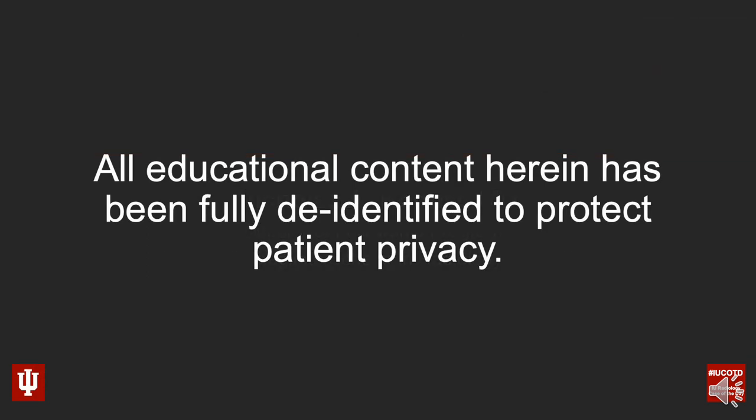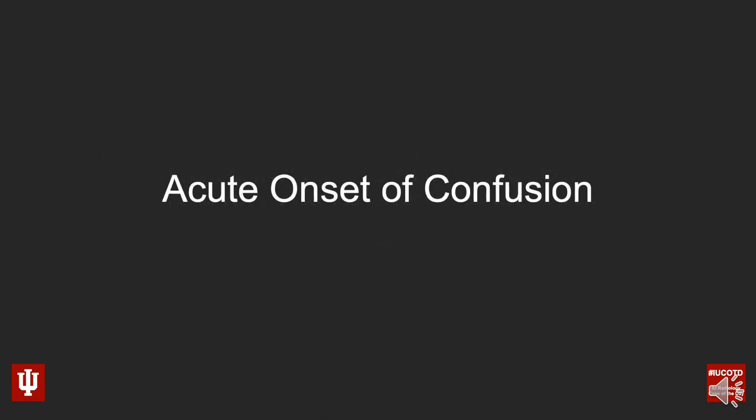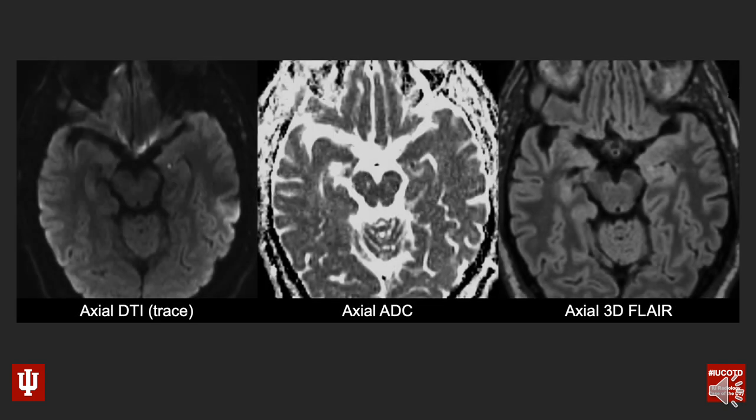As always, I'd like to start out by saying that all the educational content as part of this presentation has been completely de-identified in order to protect patient privacy. This is a patient who presented with an acute onset of confusion, and I have three images for you to look at. The image on the left is an axial diffusion tensor image — this is the trace sequence.